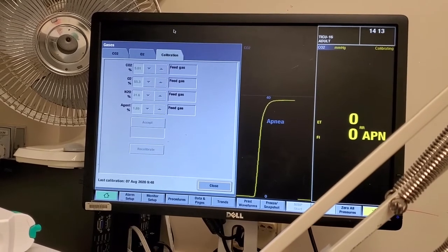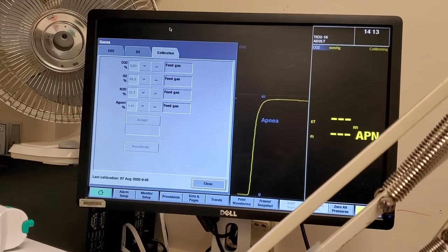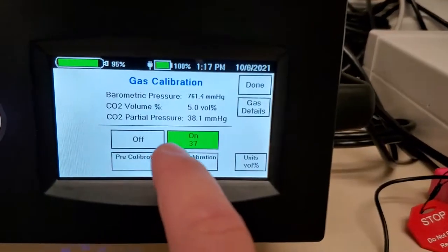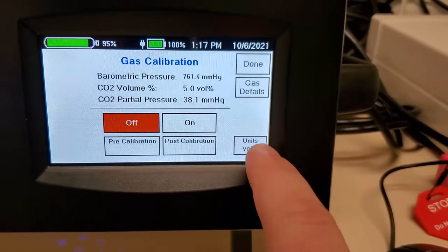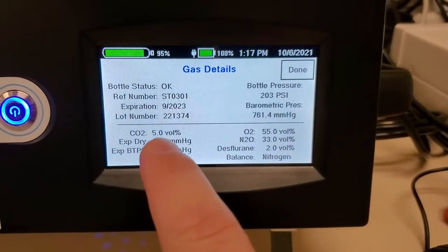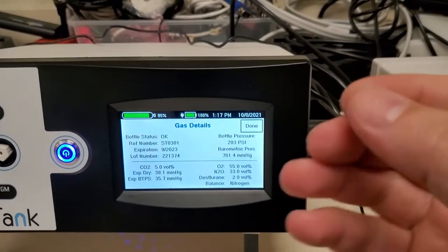Now it's going to register CO2, O2, N2O, and agent percentages. We come back here, click off, and see this little button down here that says 'gas details.' These are the values for the bottle. If you remember, I said there's an RFID badge on the bottle that has all its statistics.